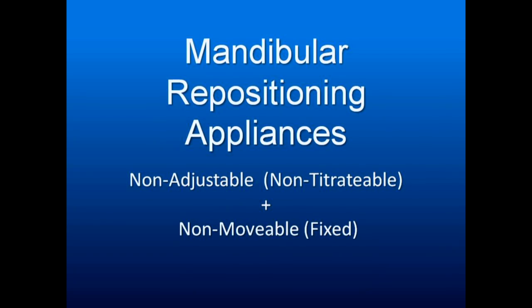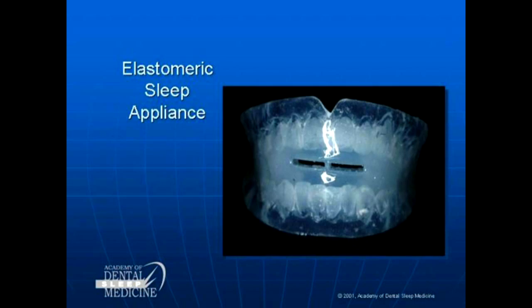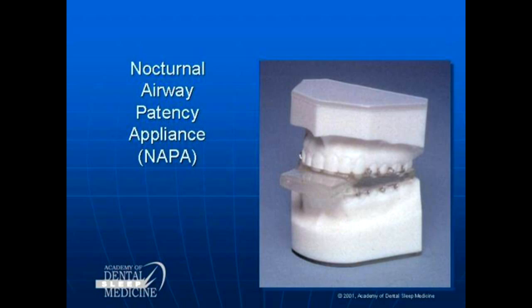Mandibular repositioning appliances that are non-adjustable, non-titratable. Old ones, we don't use them. No one's going to bite into that and not be able to move their teeth. Another, bulky, but these were our original appliances.